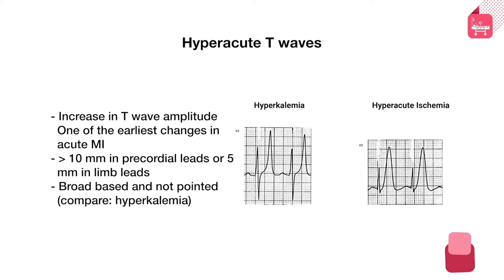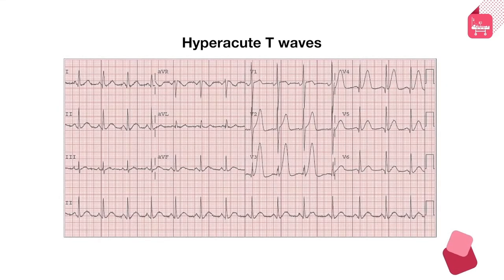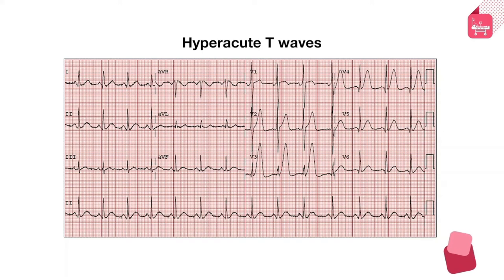The general criterion to diagnose a hyperacute T wave is a T wave exceeding at least 10 mm in precordial leads or 5 mm in limb leads. Here is an example from a person who walked into the ER with chest discomfort starting 15 minutes prior. At first look one may think there is no ST elevation and everything looks fine, but from leads V2 to V4 there are very abnormally tall hyperacute T waves representing impending anterior wall MI.